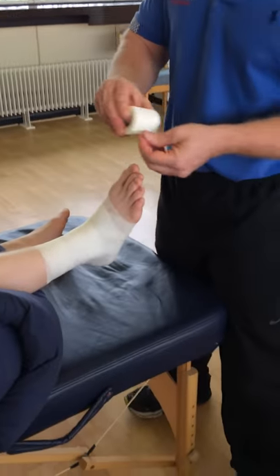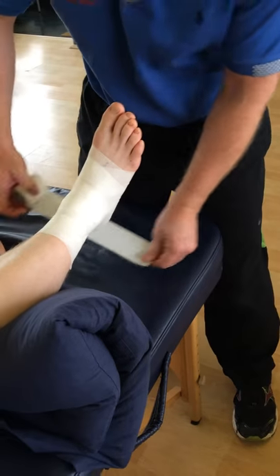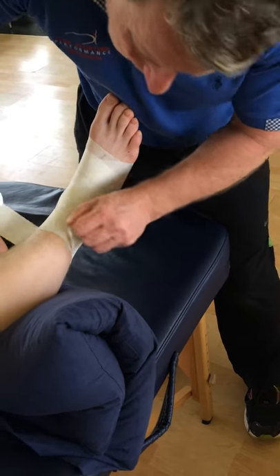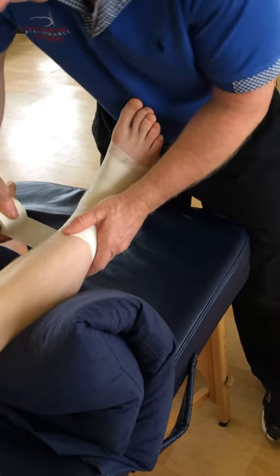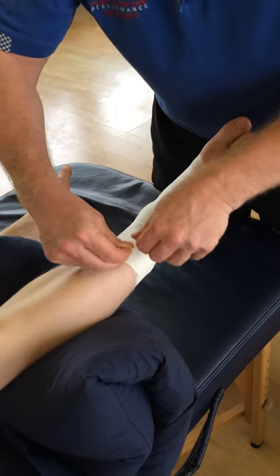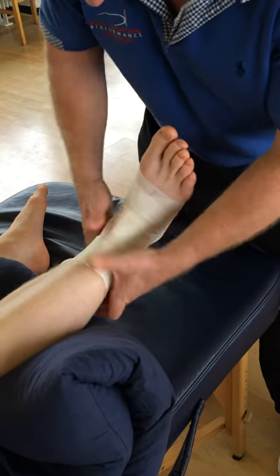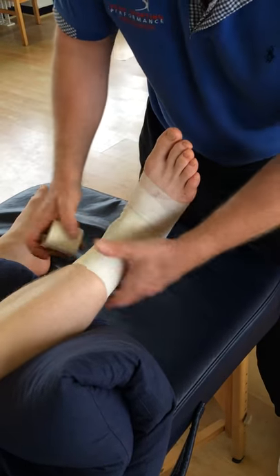What we're going to do now with the power tape is bring that posteriorly and then stick it directly onto the PowerFlex. There is a technique to rip that tape — you can use scissors if you prefer. That forms the anchor.